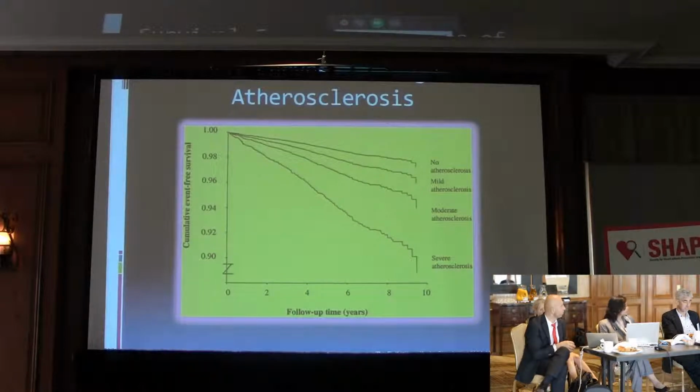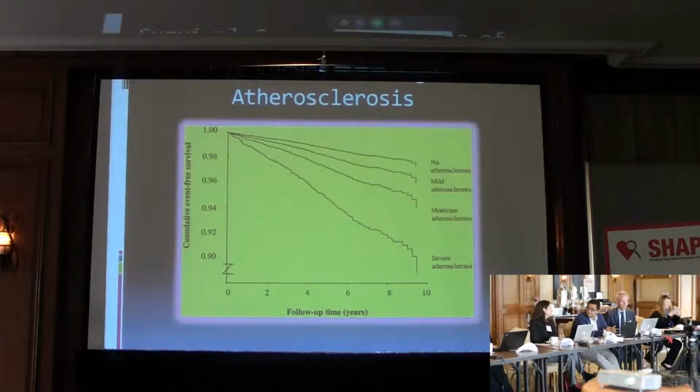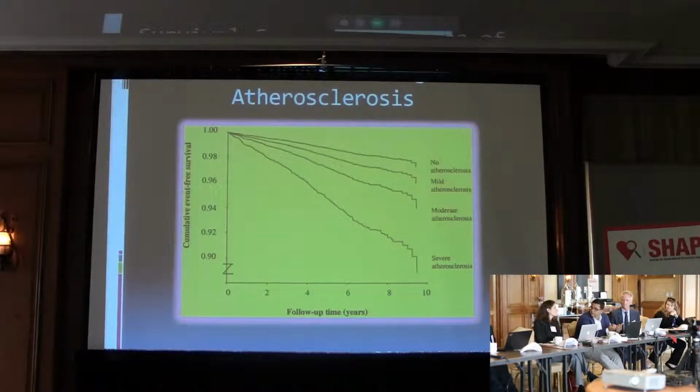So the only bad news is that people have to take off their pants. And the other bad news is, of course, if the BMI is over 35, it may be more challenging. I can basically back up what you're saying from our work in PESA and what we're doing in New York now. We have 3D plaque in almost all our studies, and it's exactly that. But it's basically doubling the carotid time. The only additional discomfort or time-consuming thing is the disrobing.